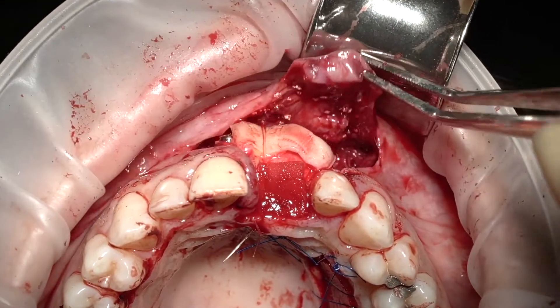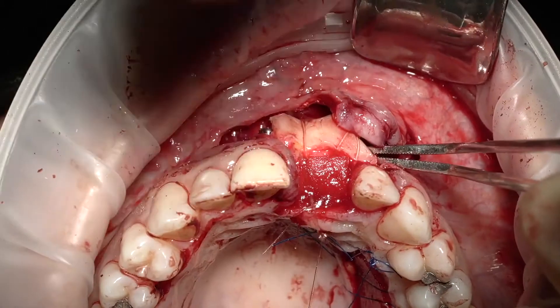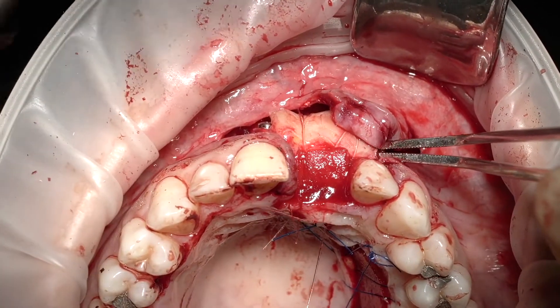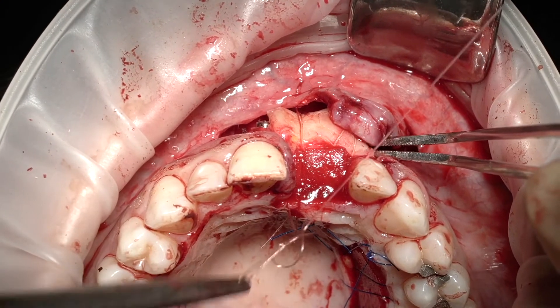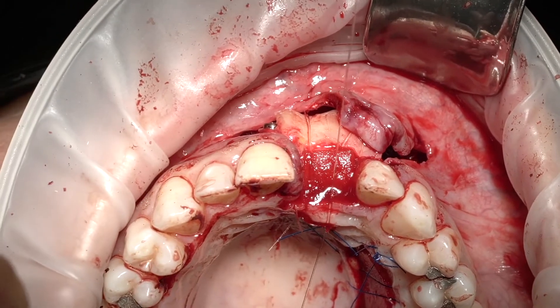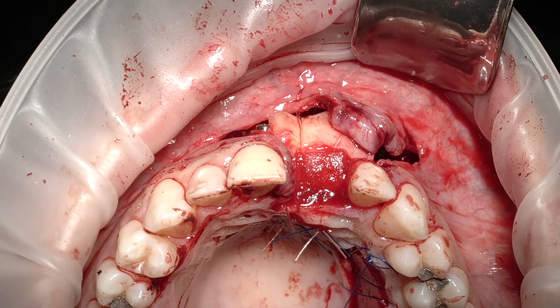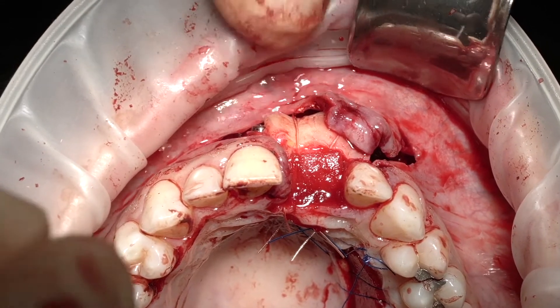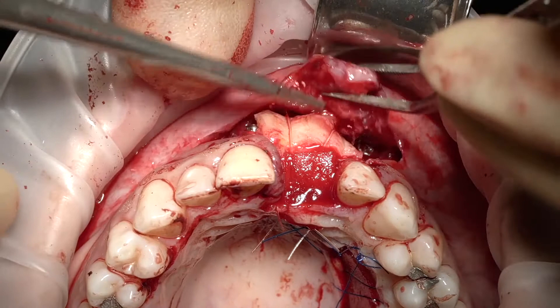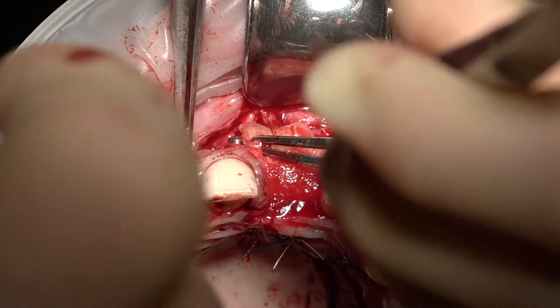Here we go — that's the first stabilization suture, and we're going to do the second one now. Beautiful soft tissue management by Victoria — it's really good to have a colleague working with you, it saved us lots of time. While I was working on the mucoderm, Victoria done the soft tissue graft for us. That's my last stabilization suture, and then we'll start closing.